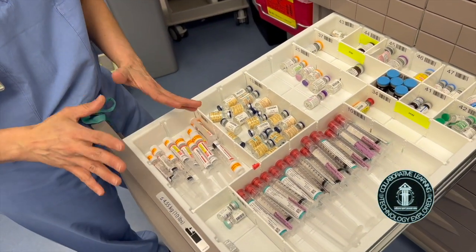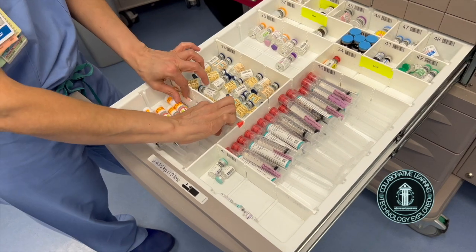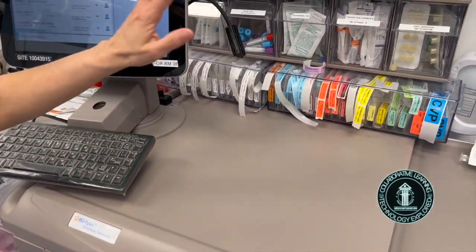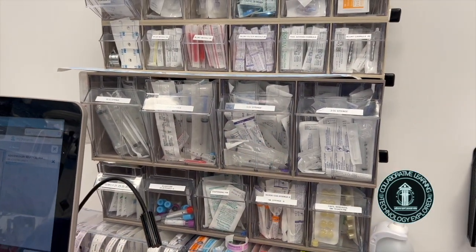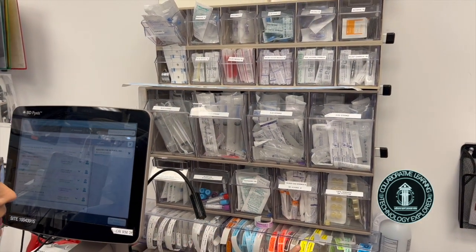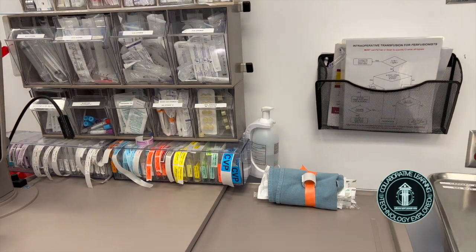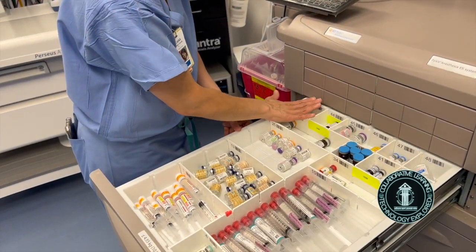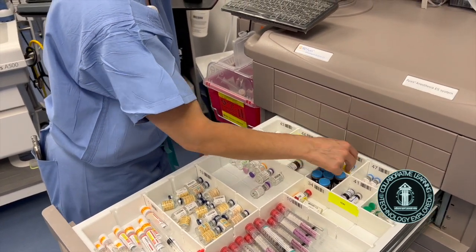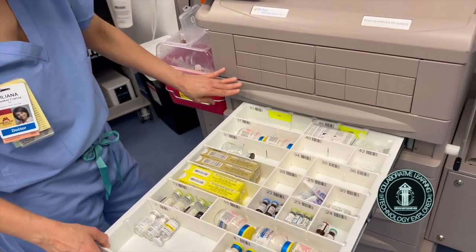Also, depending on supply chain, sometimes these medications will be already pre-packed, but sometimes they will not be pre-packed. We also keep handy empty syringes of different sizes and pre-printed labels, so that in case we need to draw our own medications, it will be very easy to identify it and avoid any medication mistakes. Other medications that we keep already here are phenylephrine, neuromuscular reversal, Zofran, Decadron, and some blood pressure medications like labetalol and esmolol. If we were to need additional medications, some of those will be here.